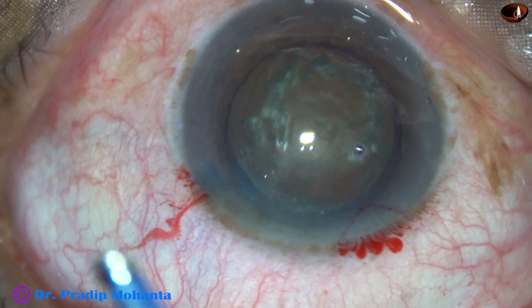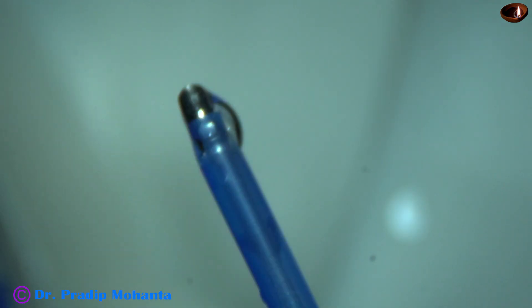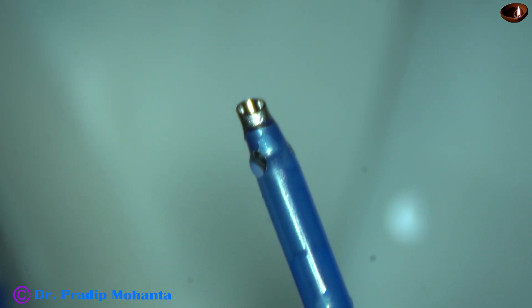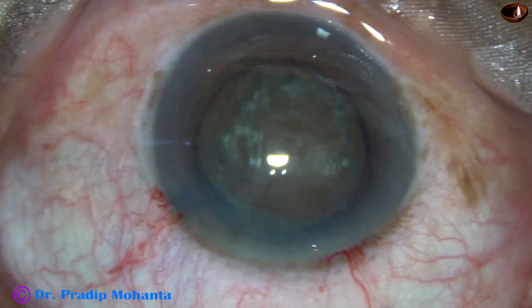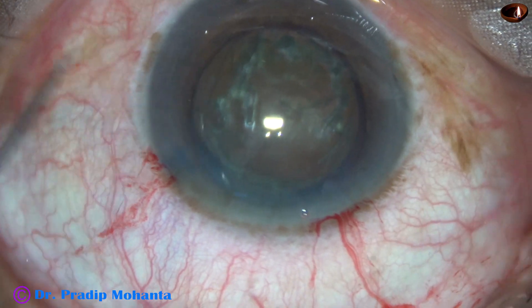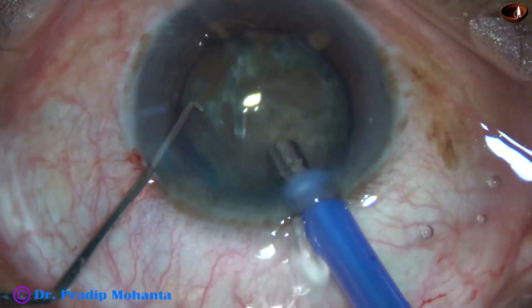Now is the time to introduce the phaco needle. The usual exposed part is for grade 3 cataracts, and I am going to make the exposed part a little more for this hard cataract. So I rotate the sleeve and expose the tip a little more. And now let us see the submarine chop technique for hard cataracts.